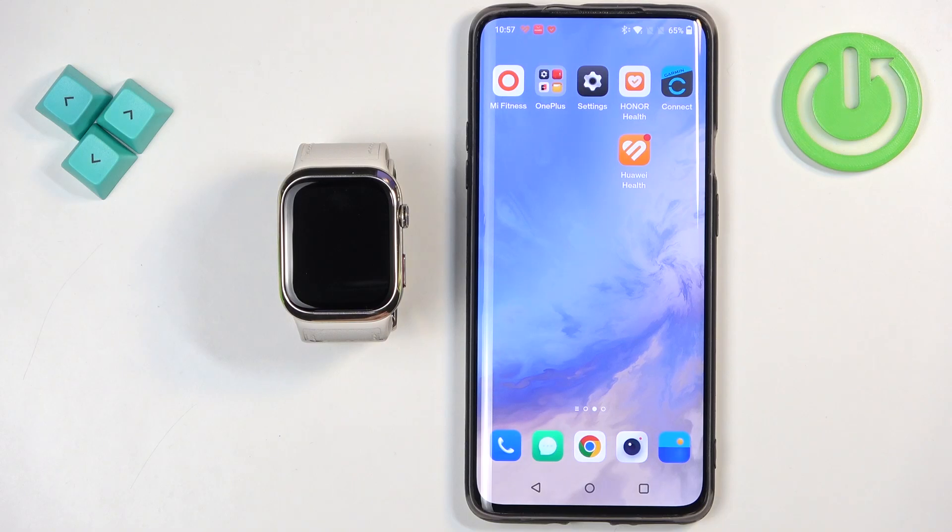Welcome. In front of me I have the Huawei Watch D2, and I'm going to show you how to install the firmware updates on this watch.